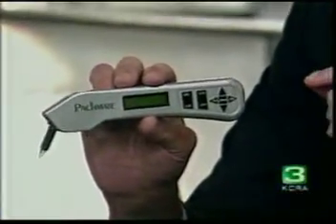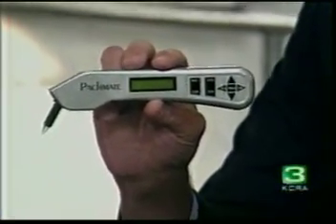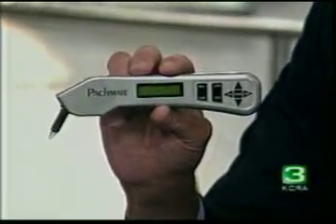If their cornea is too thin, it eliminates them from the possibility of being able to have accurate and predictable corneal refractive surgery. So we actually probably eliminate about 1 in 20 people after they've had this test alone, because they're not good candidates based on that alone. Because there's some people who think that anybody can have the surgery, and that's not the case, is it? That's absolutely false. It takes a fair amount of screening, usually about 2 or 3 hours of testing, to make sure someone's a good candidate for this.